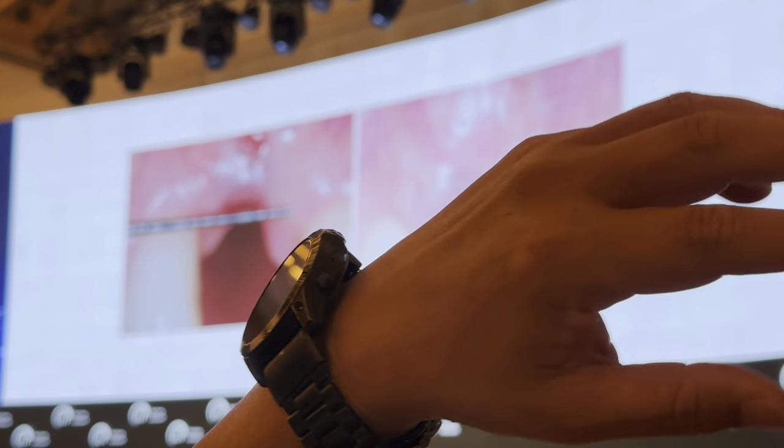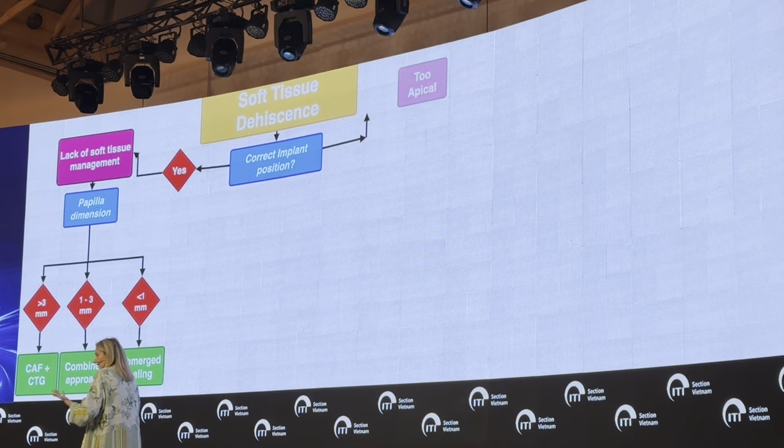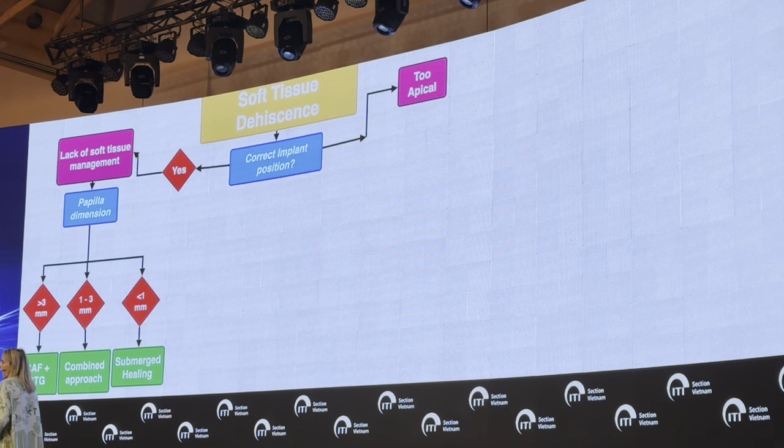And this is the smile of the long term that allow nowadays to have long-term results with more than 10 years of follow-up with this mucogingival procedure.